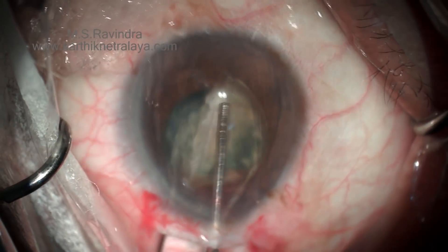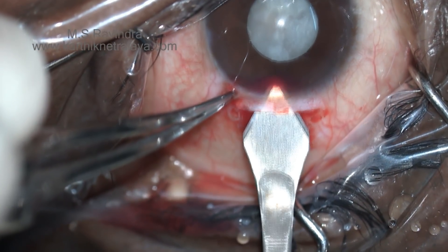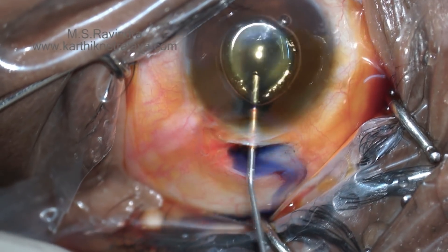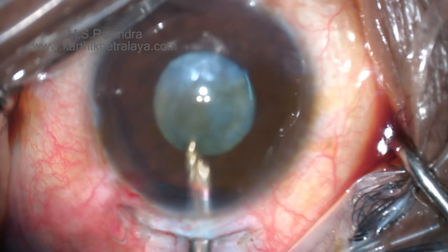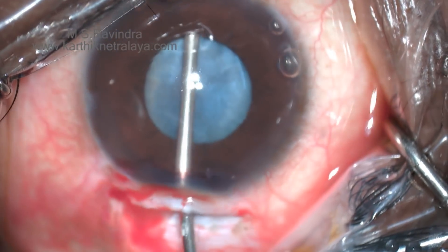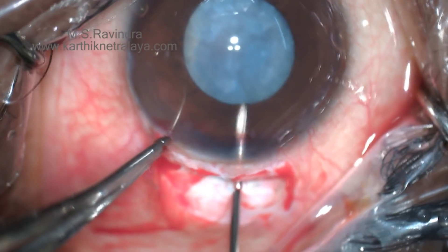The two hemi-nuclei are removed; you aspirate the cortex and put the lens. In another case with a white swollen cataract, the anterior capsule is stained, filled with viscoelastic, and then a tunnel floor entry is made with the cystitome.